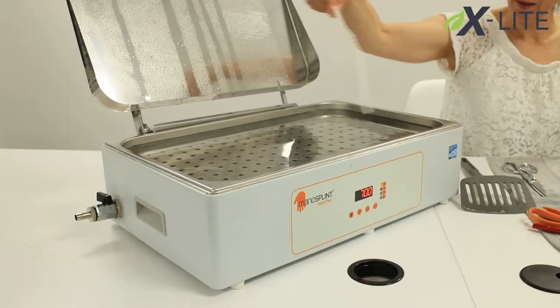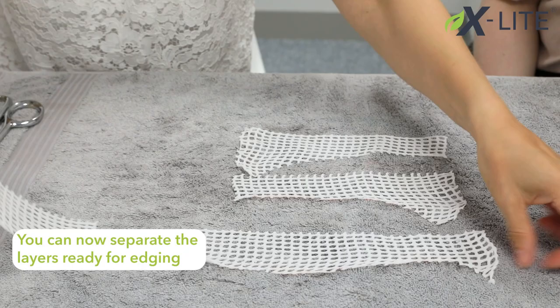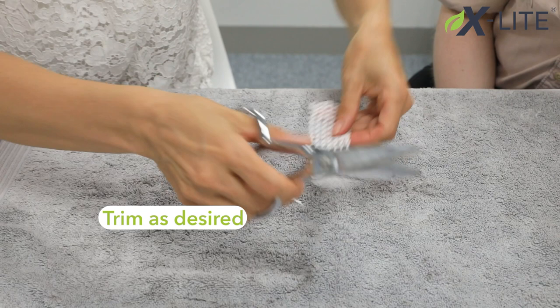Now activate the offcuts in the heat pan. You can now separate the layers ready for edging. Trim down the offcuts as desired. Once activated in the heat pan, you can edge your splint.